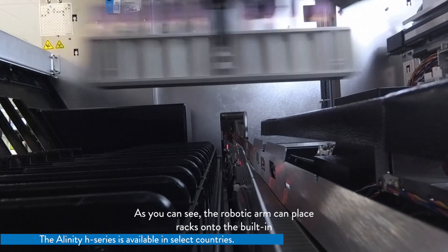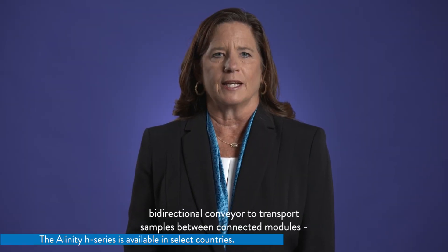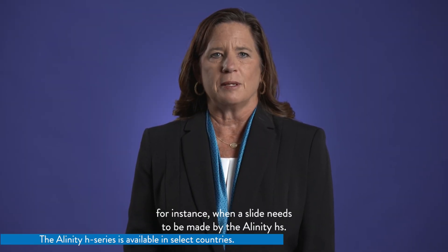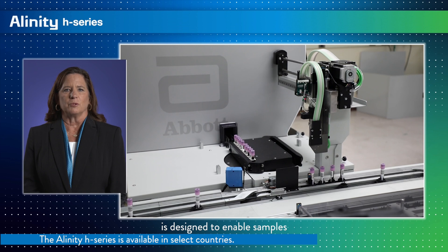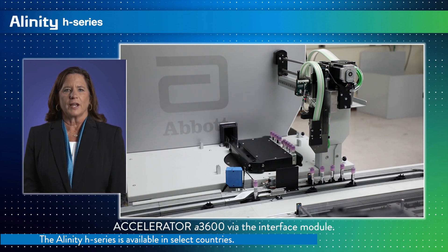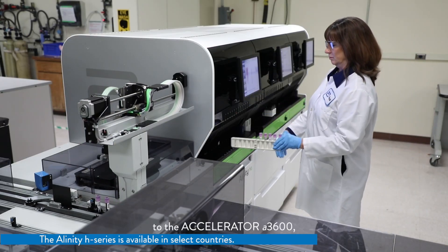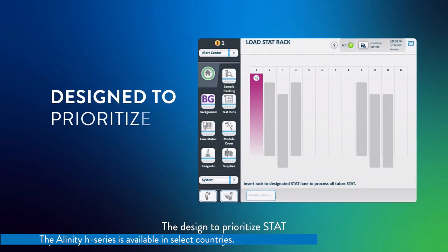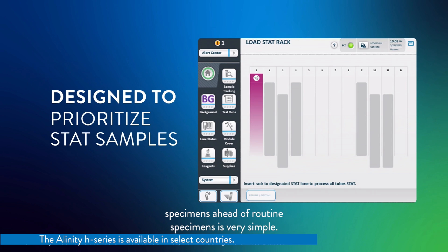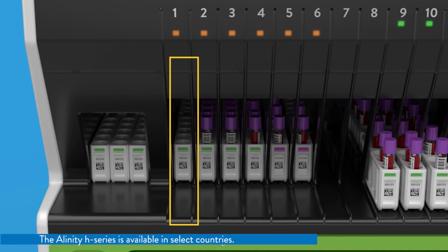The robotic arm can place racks onto the built-in bidirectional conveyor to transport samples between connected modules — for instance, when a slide needs to be made by the Alinity HS. The bidirectional conveyor is also designed to enable samples to be transferred to the Accelerator A3600 via the interface module. Even when the system is connected to the Accelerator A3600, samples can still be loaded at the front of the system. To prioritize stat specimens, one would simply load a rack with stat tubes and insert the rack into a designated stat lane. This rack will then be processed next — it's that easy.